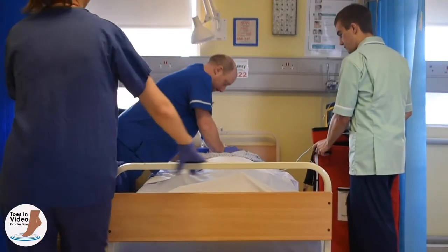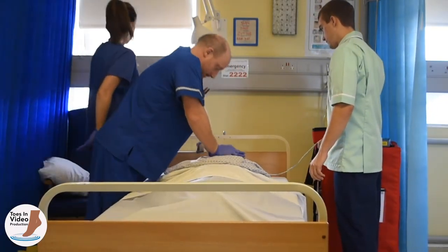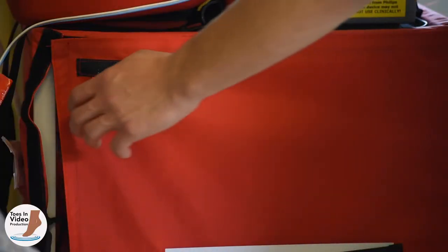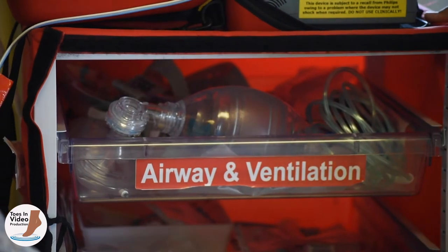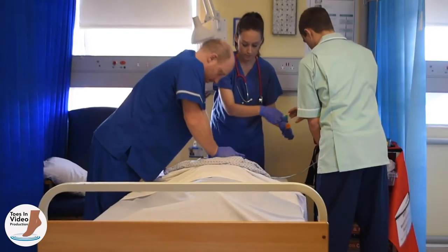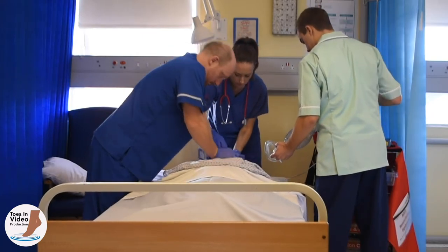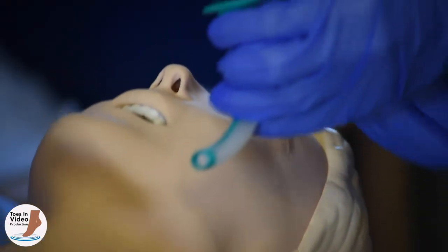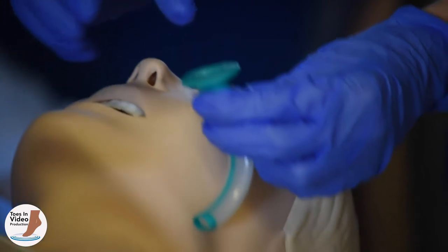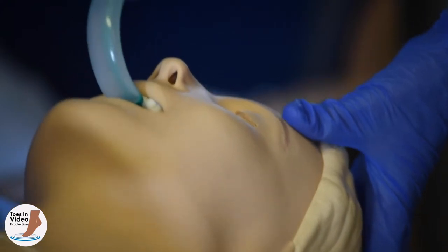Ensure the person managing the airway has adequate safe access to the patient's head by safely moving the bed out of the bed space, removing a headboard where possible, and removing any pillows to allow you to open the airway. For rescuers with non-specialist skills, the bag valve mask device is used with a two-person technique, with an oropharyngeal airway or OPA in the unconscious patient. These devices are measured using the vertical distance from the patient's incisor to the angle of their jaw — find the OPA that best matches the size of the patient's airway, preferring too large over too small if in doubt.